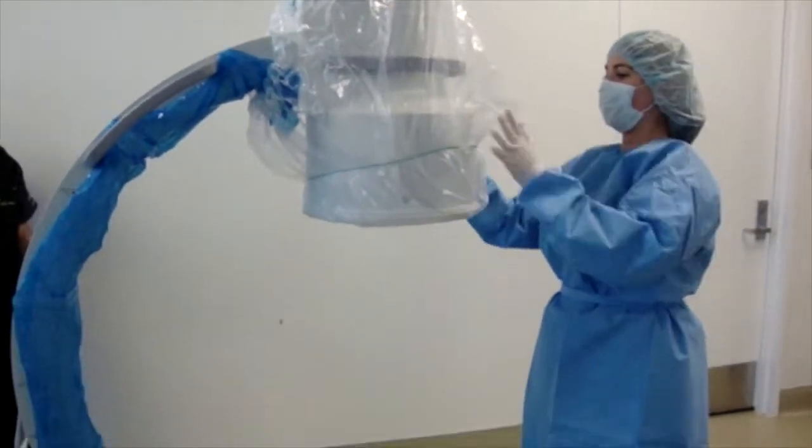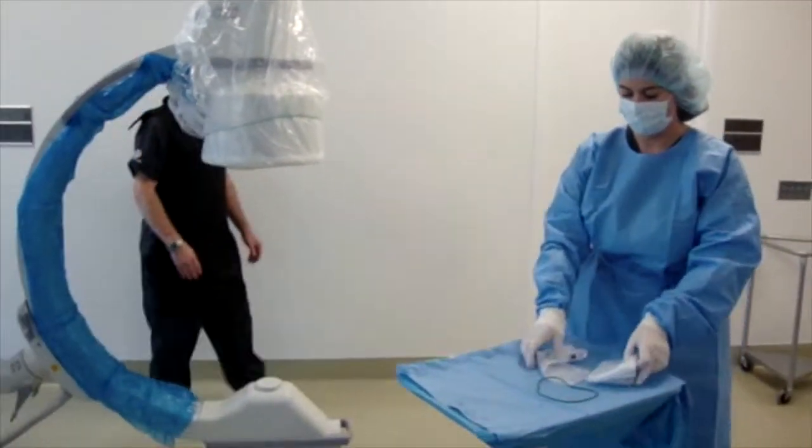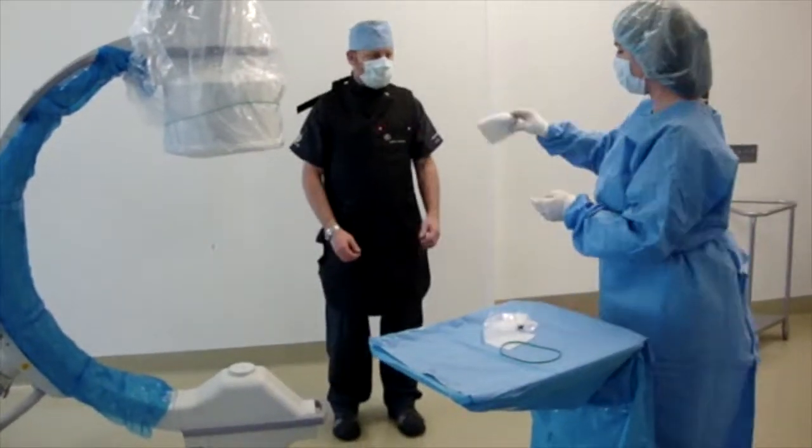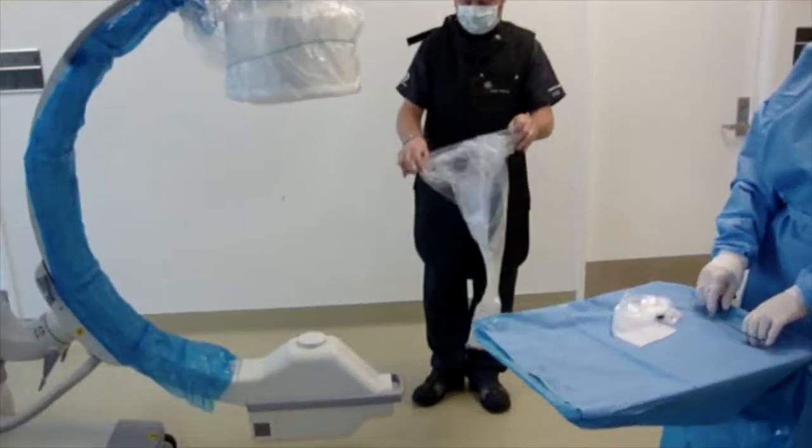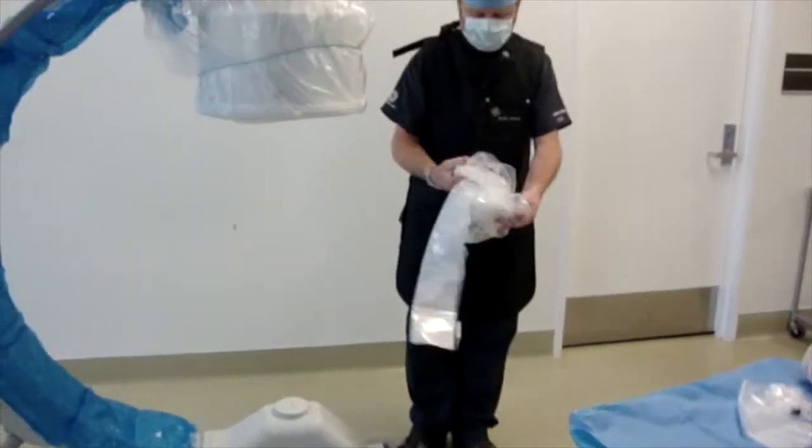For the bottom x-ray tube drape, this is not considered a sterile area since it is below the waist and under the table. Therefore, it can be applied by a non-sterile person.